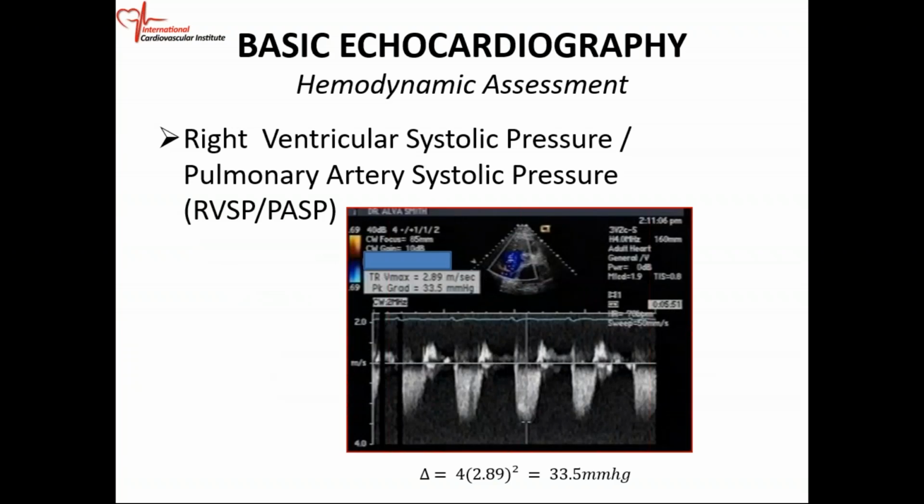All right, we have been doing a lot of echoes, and this is an example of tricuspid regurgitation. This is a short axis at the level of the aorta. So this is your right ventricle right there, the tricuspid valve is right there, and this is the right atrium. Your probe or transducer is right there.